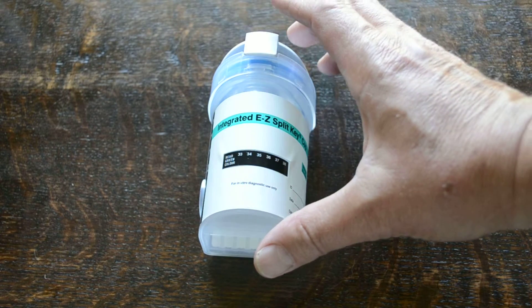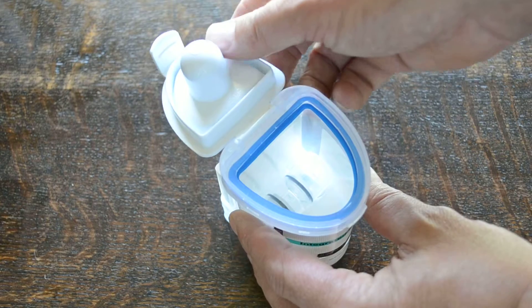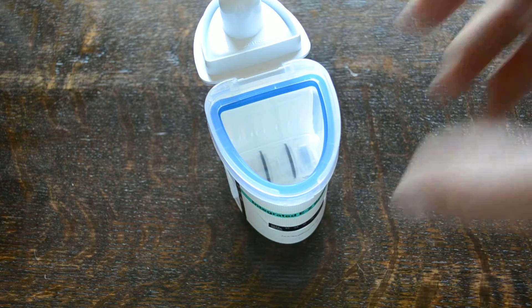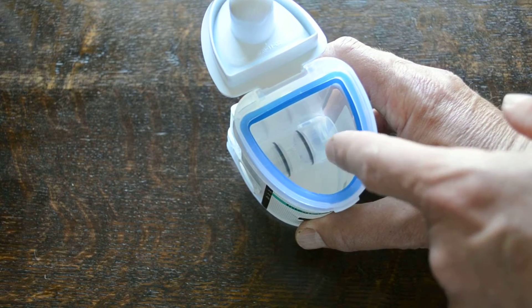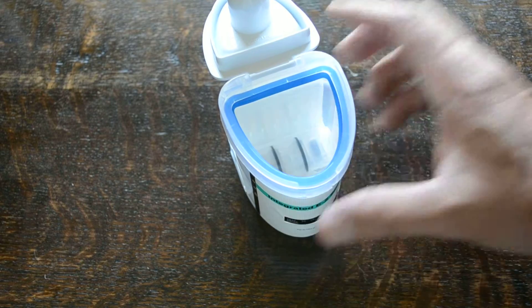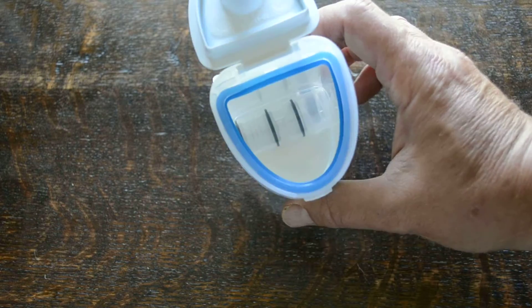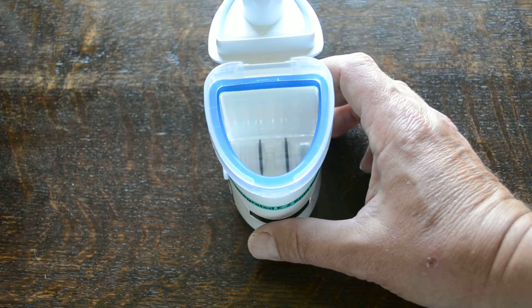A lot of tests in cups look like this but haven't got the integrated split cup feature. If we open this and show you the collection system, you'll see there's a round circular chamber in the bottom. The collection chamber in the front with the double seal on the top allows for a urine sample to be collected from the donor, either male or female.